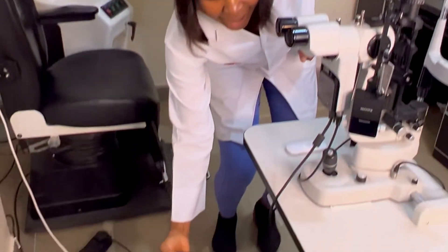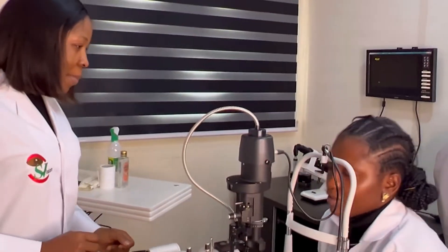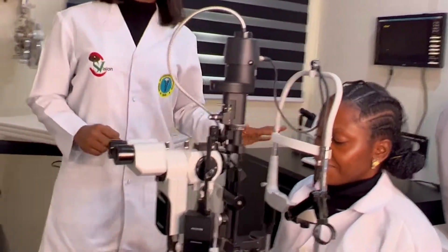After the wheelless seat, next is your patient preparation. I'm going to be using someone to demonstrate how you prepare your patient. This is Dr. Sylvia; she's going to serve as my patient to demonstrate patient preparation during slit-lamp biomicroscopy. The first thing you need to do is educate your patient on what you want to do. Remember, your patients are not robots, so tell them what you want to do. This helps the patient to flow with you. There are certain instructions you need to give them to guide and enable them to cooperate with you during your test.